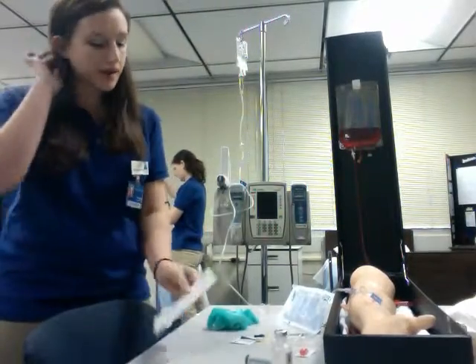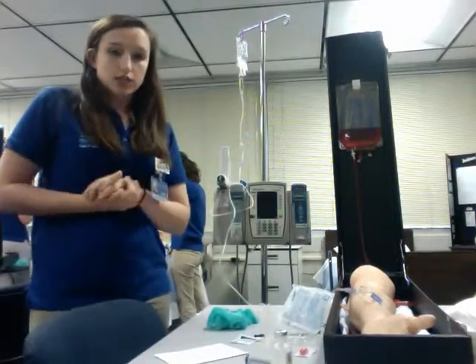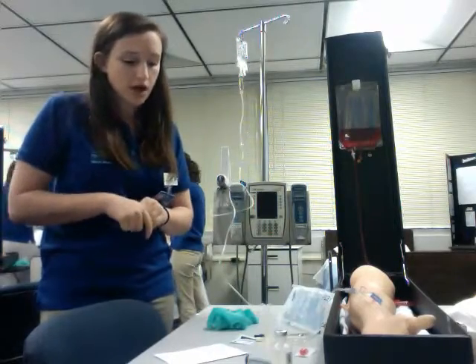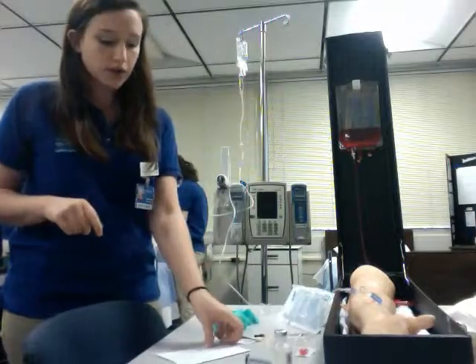So I'm going to start by looking at my MAR to see the doctor's orders. Today the doctor has ordered Flagyl via IV at 500 milligrams every 6 hours, mixed into 100 milliliters of normal saline. So I'm going to look at my drug card.